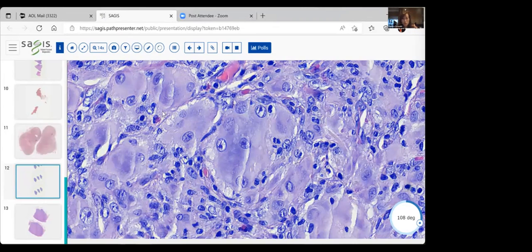It's not too unusual in this condition to have some other inflammatory cell types, like some eosinophils scattered about, or lymphocytes.